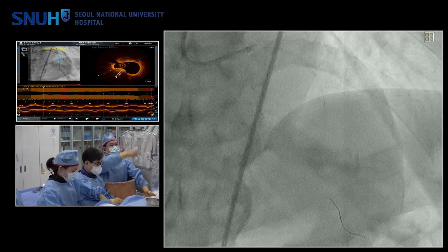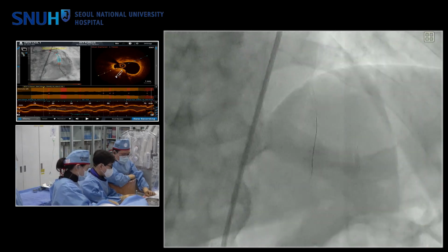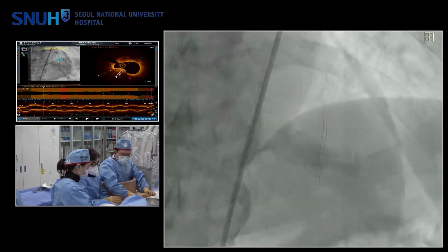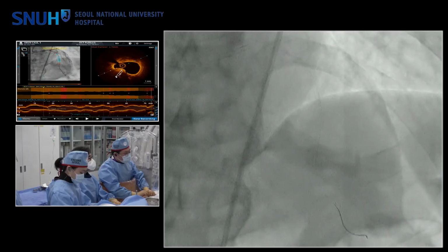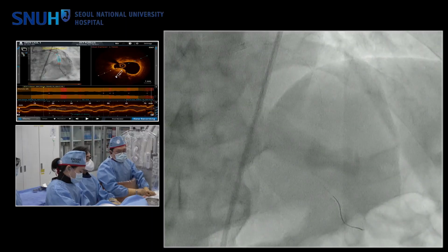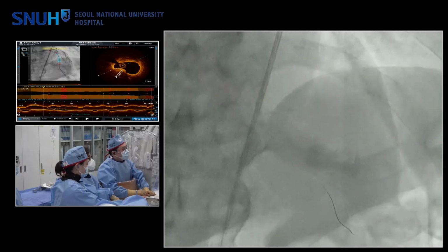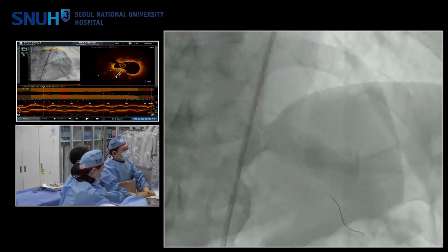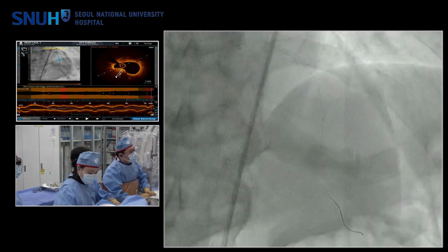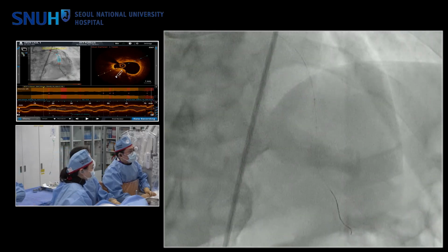And I think there were some good lessons from the Eclipse trial. The Eclipse trial showed heavily calcified arteries, and actually in the balloon-only arm, they achieved big MSAs. The MSAs were, I think, 6 or 7. Heavy calcification on the angiogram doesn't mean you need IVL, and it's great that they did the intravascular imaging here, both IVUS and OCT, and obviously OCT has some advantages in terms of thickness.